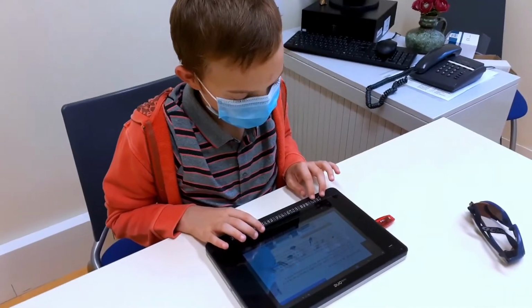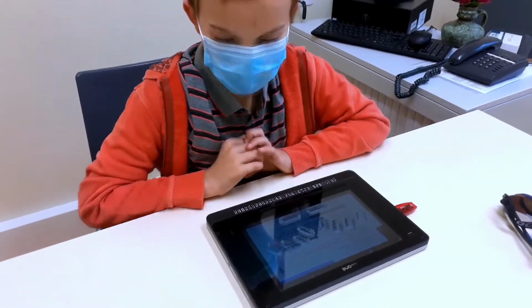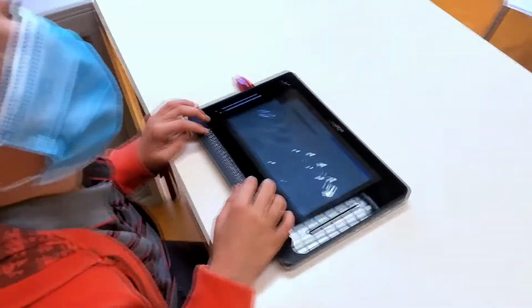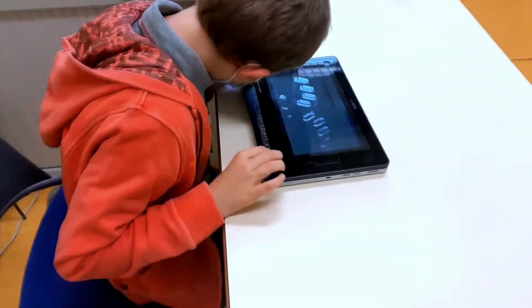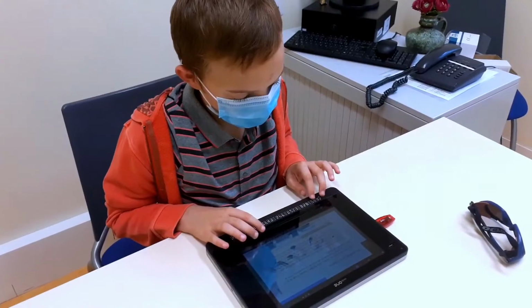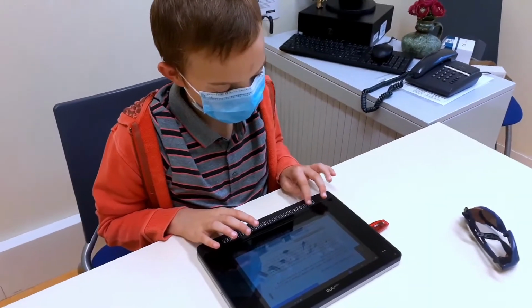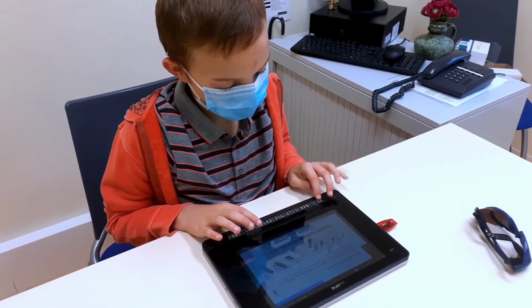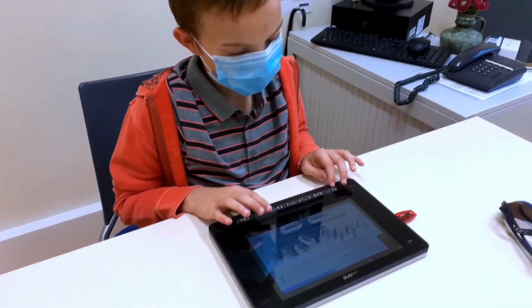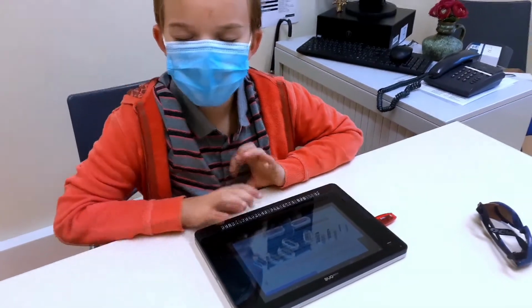To read an audio file that the teacher gives me, I go to Windows 10, tapping twice with 1 finger on this small round zone, and after I go to this PC in order to see the audio file. Okay, go ahead then. Do it. And how do you turn off the text-to-speech system? I tap 2 fingers in the bottom slider, just once.